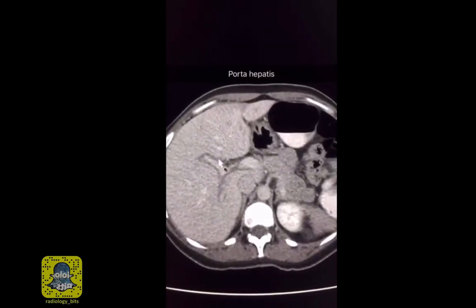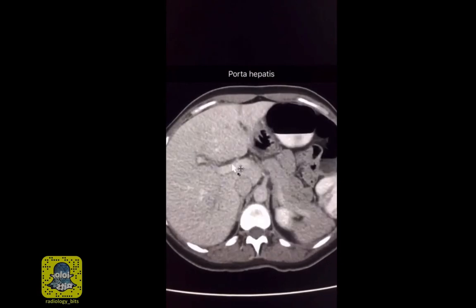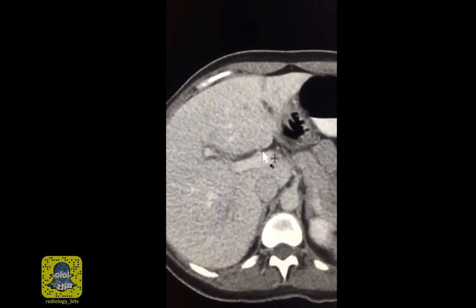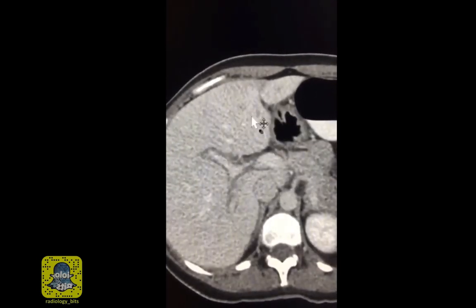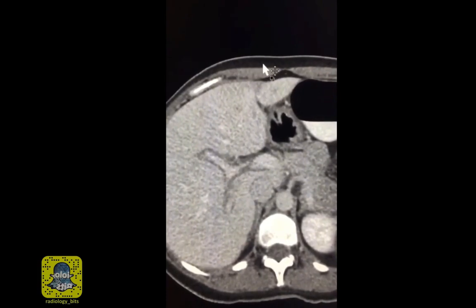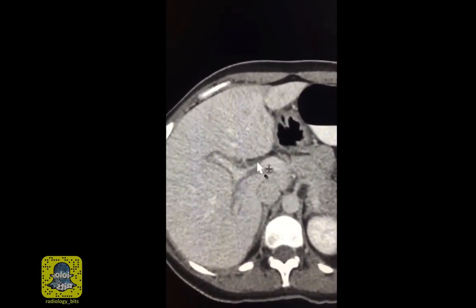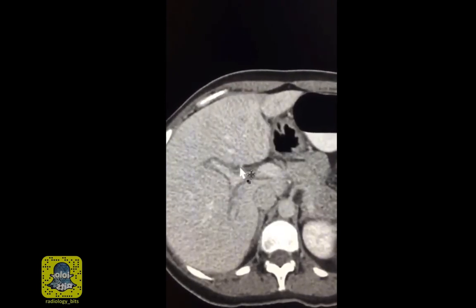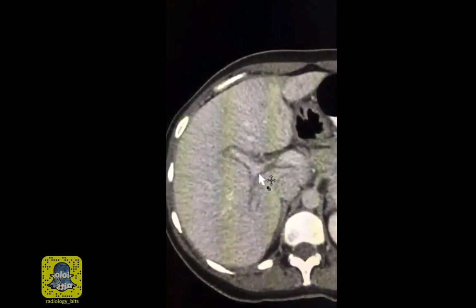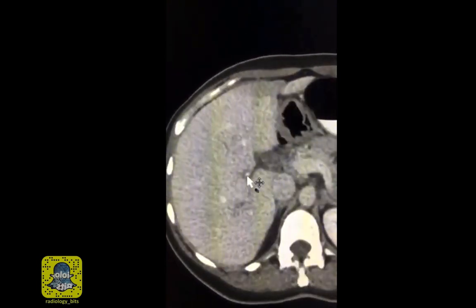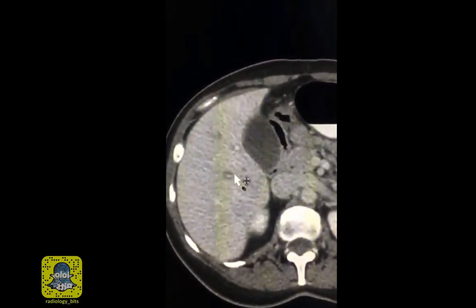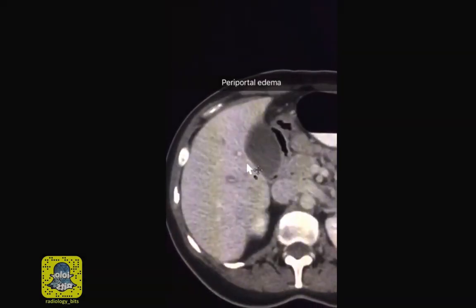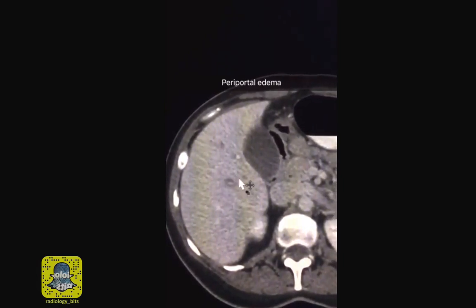This is the porta hepatis, the entrance into the liver, and this is your portal vein. The space surrounding the portal vein should be clean — it should contain fat as clean as the subcutaneous fat. However, the fat around the porta hepatis appears to be dirty or stranded, and if you follow the branches of the portal vein within the liver you're going to see the same appearance with fluid surrounding these portal triads. This appearance is called periportal edema.